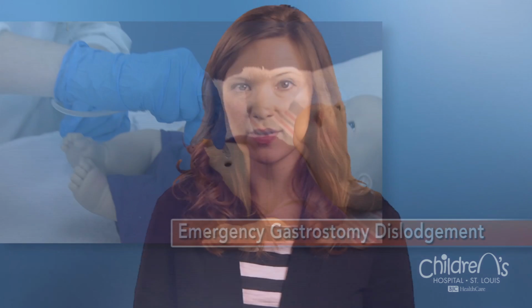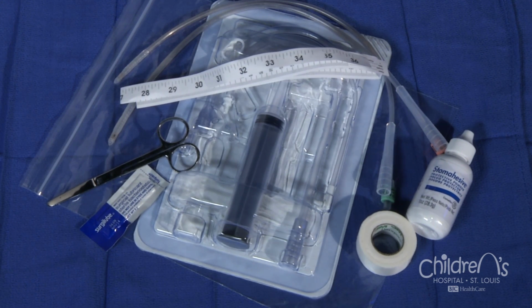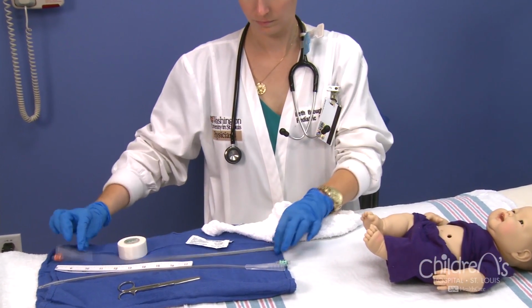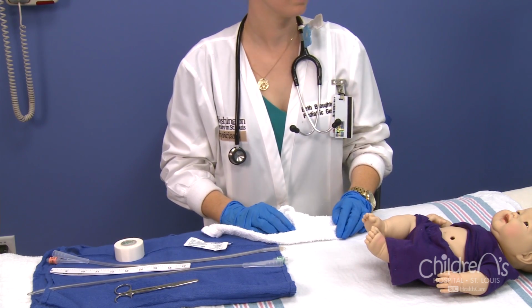Gastrostomy appliances, on very rare occasions, may come out. There is no immediate danger to your child. Formula or food may leak from the site, or you may see a small amount of bloody drainage. If your child's appliance comes out within 2 months of surgery or before the first gastrostomy change, you'll need to take several steps. You will be sent home with a take-home bag and 2 replacement tubes called Foley catheters. One that is the same size French as the one found on your child's button, and one that is 1 size smaller. Make sure to keep these items in a handy location at all times.